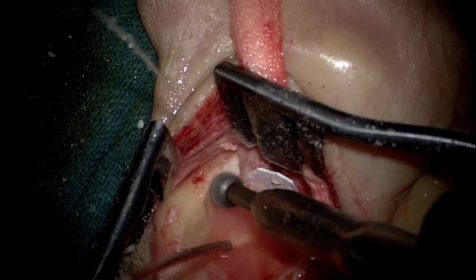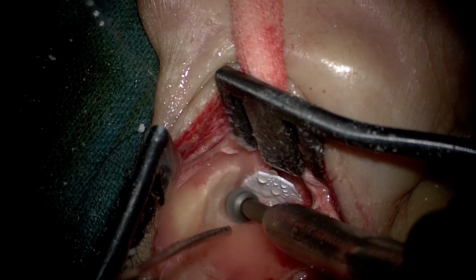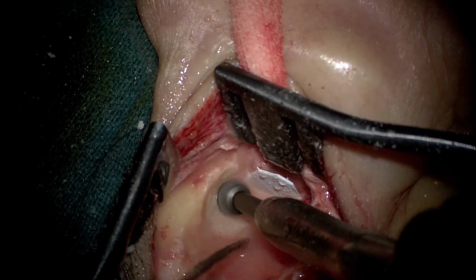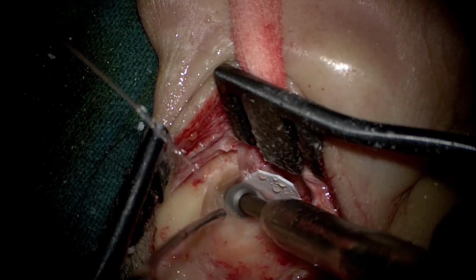approach. As you see, we have placed a shield cover for the protection of the tympanomeatal flap so that it does not get injured in the drill use. And here we are doing an inside-out approach.